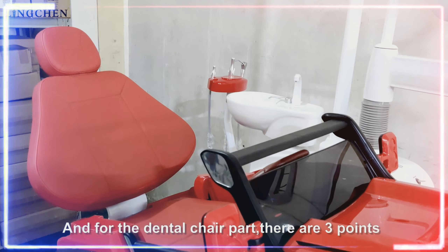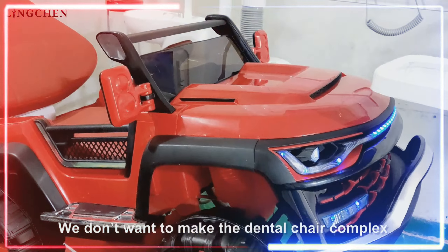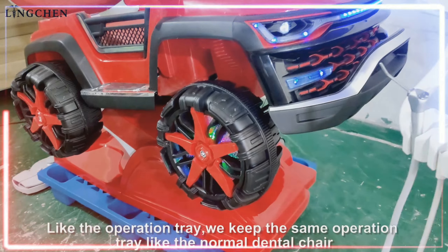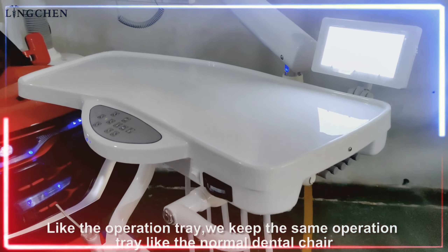For the dental chair, there are three points. First is the design. We don't want to make the dental chair complex. We keep the same operation as the normal dental chair.